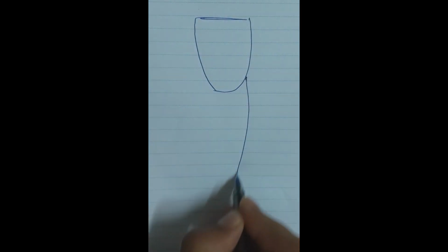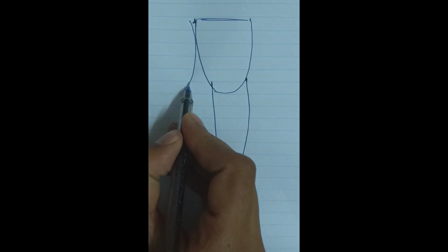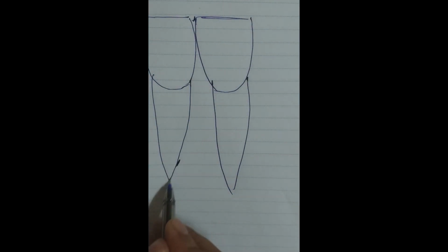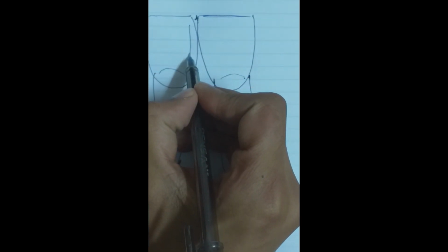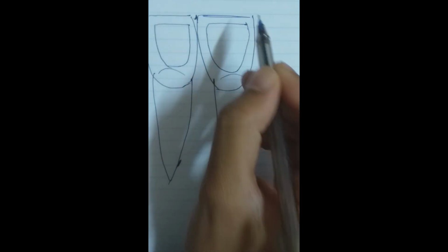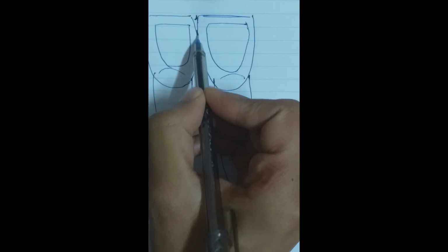This is from lingual. Here is the contact between both teeth.